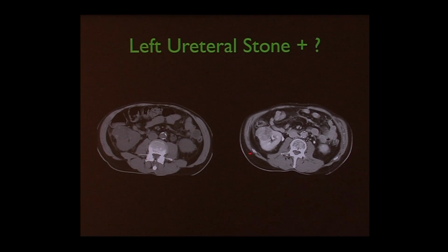And there's the kidney now enhanced with the IV contrast that we gave it, and it's excreting contrast. So these white areas now are the urine opacified by the IV contrast, and it's going down towards the bladder. This is the way the normal kidney would look. This is not the way the normal kidney would look.